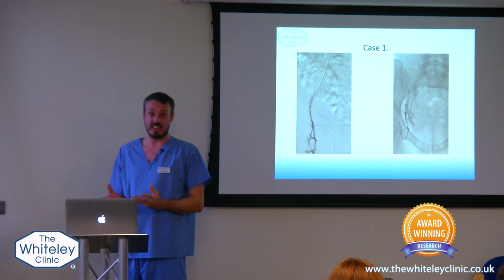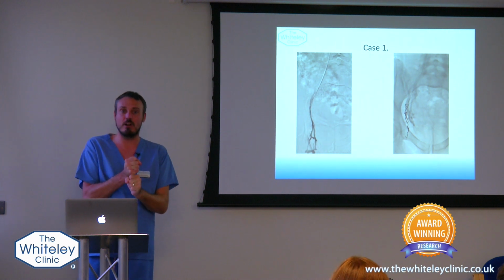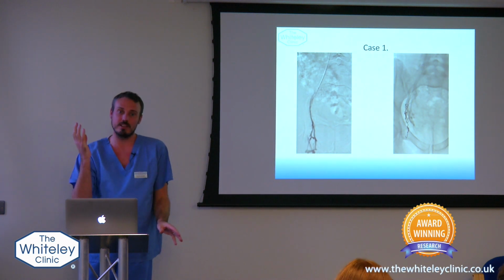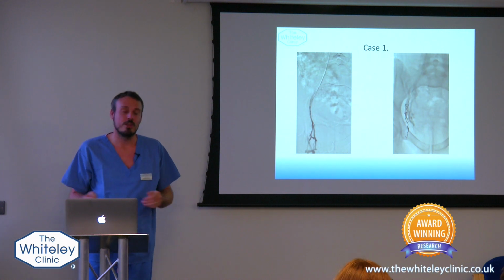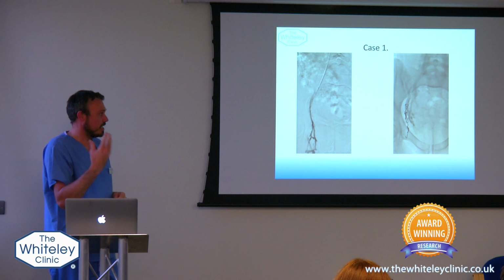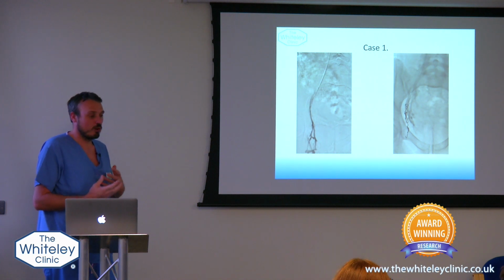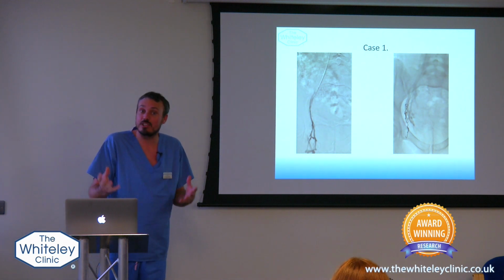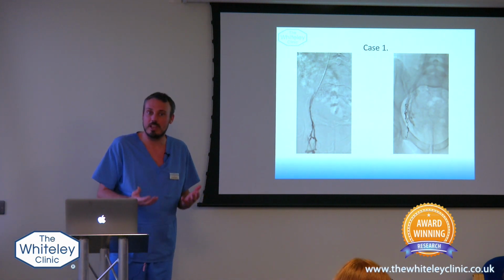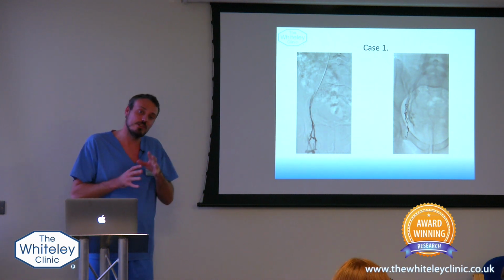The vein hates that because there's something foreign in the vein. So the vein clamps down onto that coil like that, squeezes all the blood out of it, and then that vein essentially is destroyed. So the immediate response to that, of course, is that any form of congestion may just feel a little bit worse for a day or two, because now the blood hasn't got the easy route out that it was using previously, and it opens up other routes and other veins to drain.